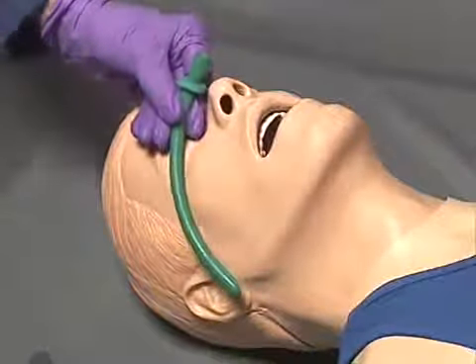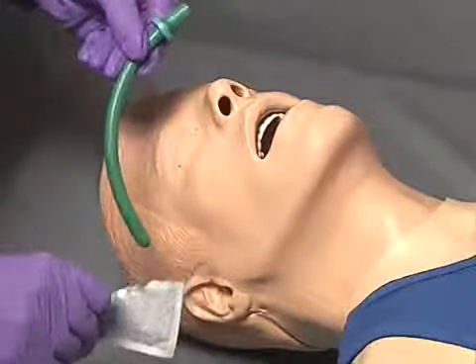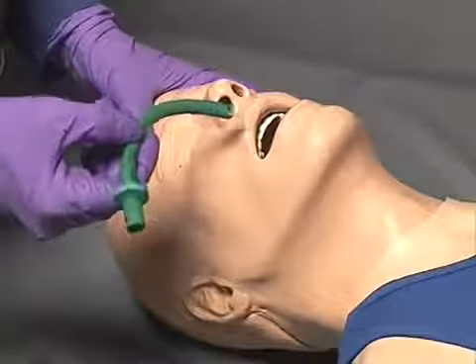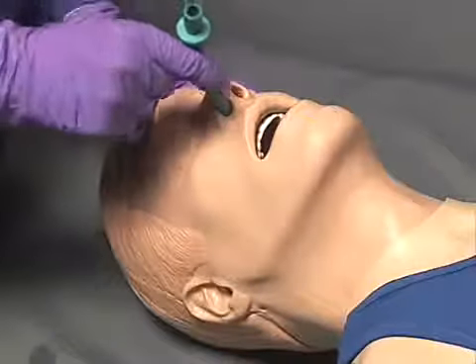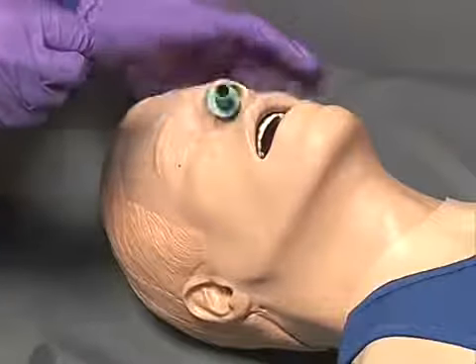Lubricate the distal surface of the airway with water or a water-soluble lubricant. If inserting the nasal airway into the patient's right nare, insert so as to follow the normal anatomical curvature of the nasopharynx with the bevel toward the septum. Direct the nasal airway along the floor of the nose into the oropharynx.